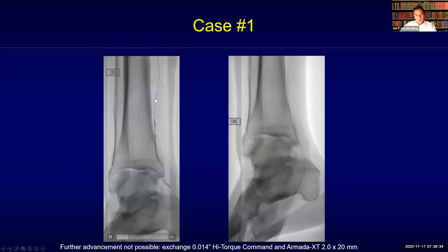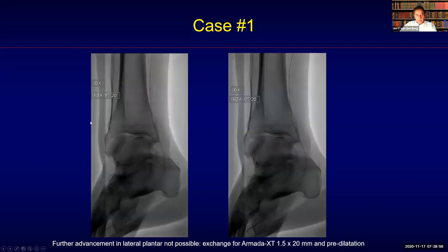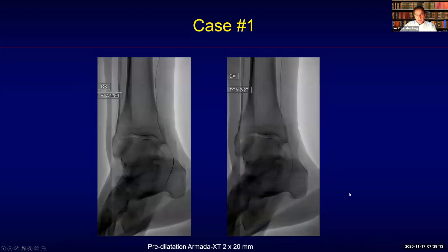As you can see here, this is the Armada XT, which I use oftentimes as a support catheter with the additional advantage that you can use it as a pre-dilation catheter afterwards. You can see that this balloon is now advancing a little bit more, and I managed to get through with the wire more distally. Then also the 2x20 balloon did not advance, so I went down with the size. The smaller size, 1.5x20, advanced and was used for pre-dilatation.